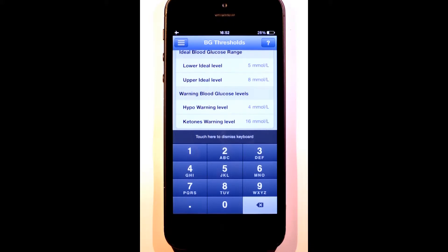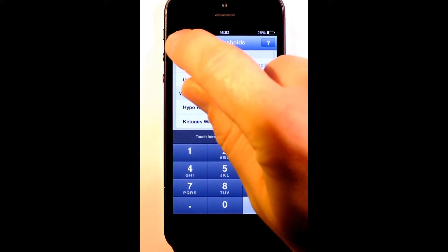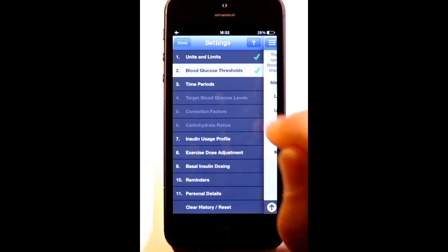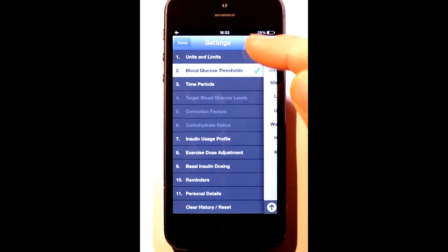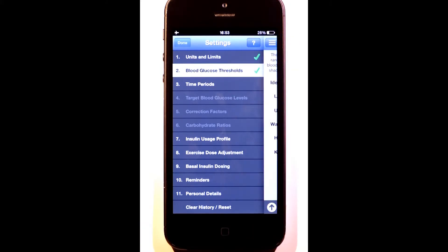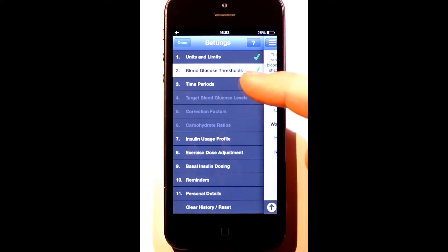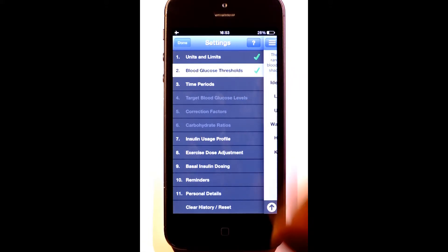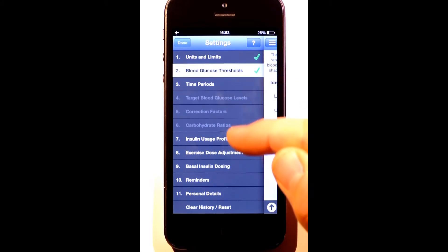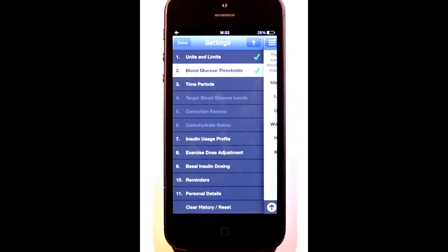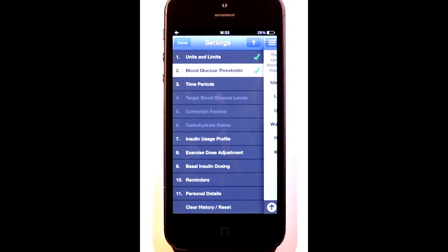I now want to take you back to the main settings menu. Straight away I can see that I've completed the first two sections because they're ticked. The next section to be completed is the time bands. The three sections after that are greyed out because I can't set them until I've set my time periods. Before RapidCalc can be used, all sections must be completed and ticked.